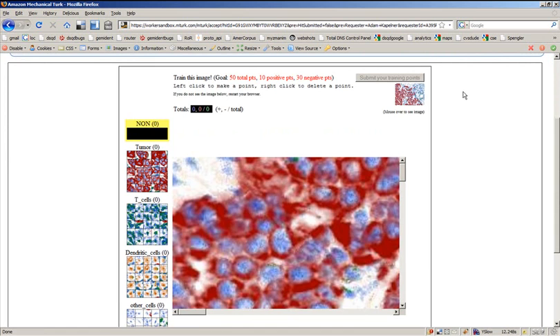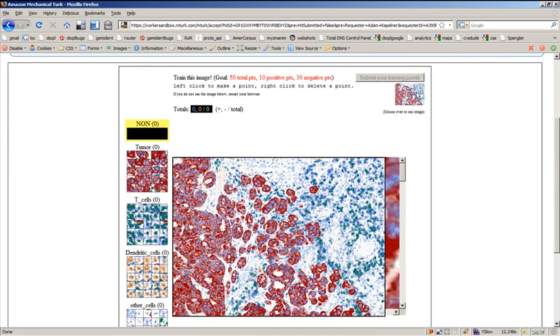Here we are. This is what the entire image looks like. You can see on the left and the bottom there's lots of tumor cells, and on the right the green would probably be T cells, and there's a mixture of other cells smattered in there, and possibly some dendritic cells.